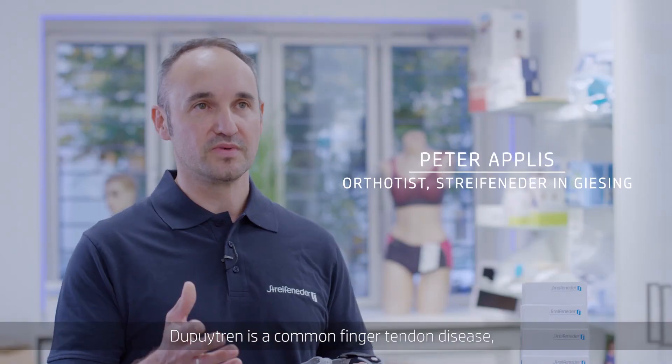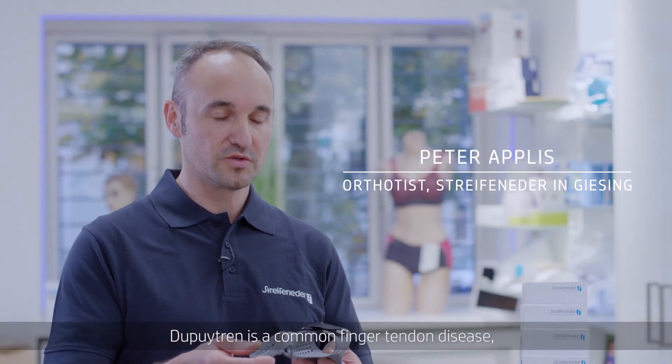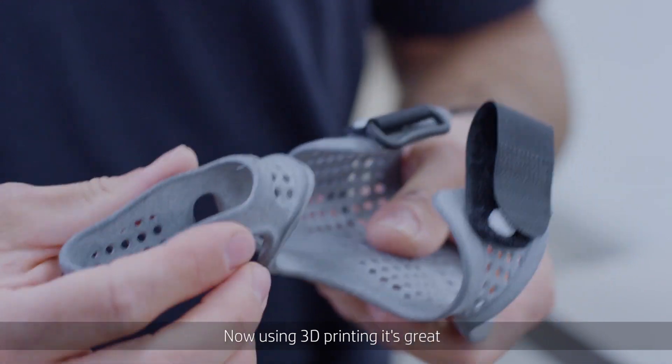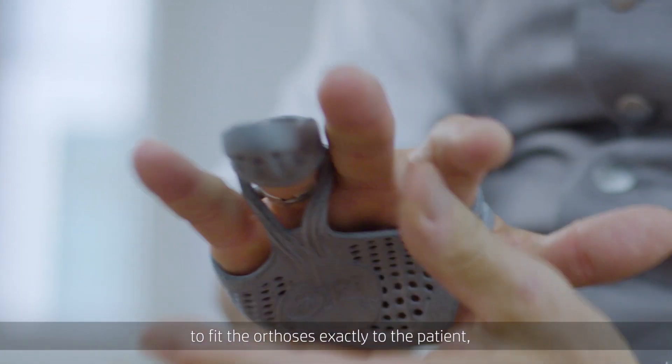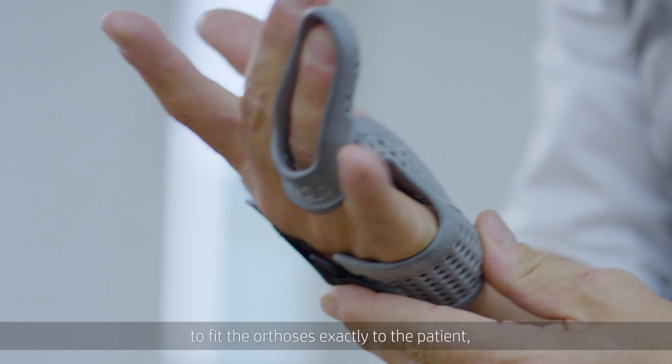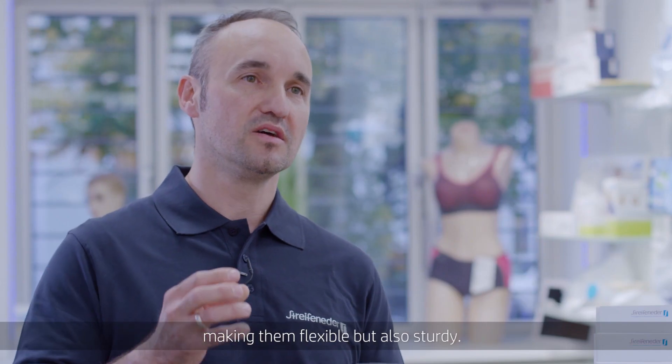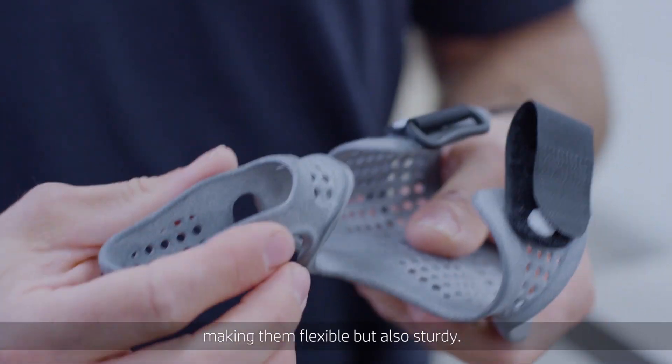In the disease — Dupuytren's is a typical finger tendon disease that you can't treat with traditional orthoses. With these 3D prints, it is of course great to focus on all the needs and to construct the orthosis so that it can be flexible, but also rigid — and that it can be produced.